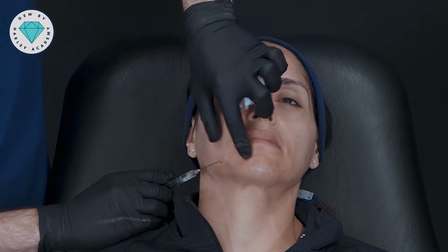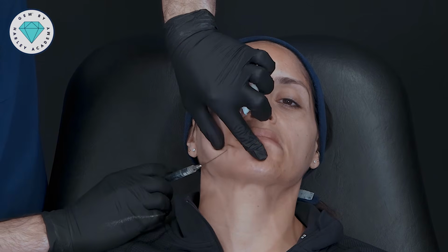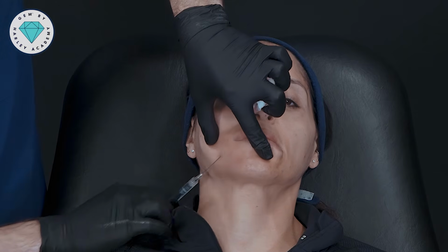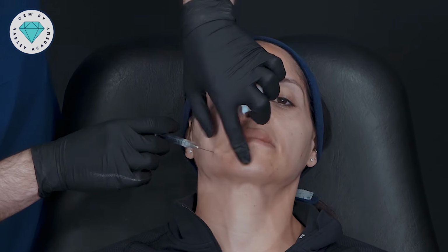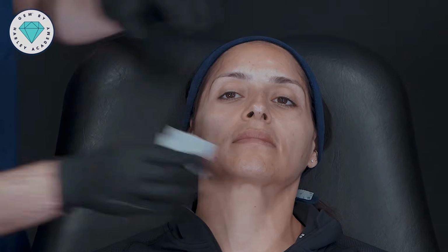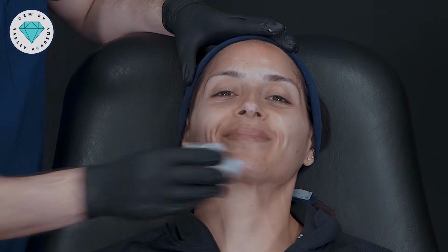It's quite normal to get a little bit of bruising here. It's not necessarily because you called any vessels, but just that pulling the muscle slightly away from the skin naturally causes a little bit of subcutaneous bleeding. Often it won't present immediately. It'll be the next day or so that you see it. That's it. That's all I wanted to do today, at least on this side.